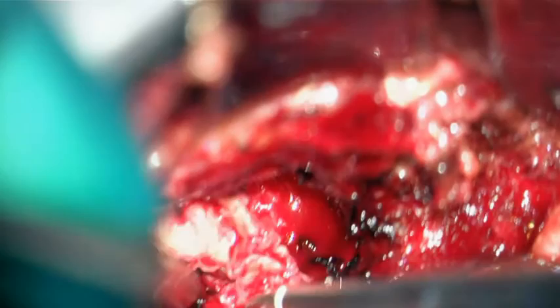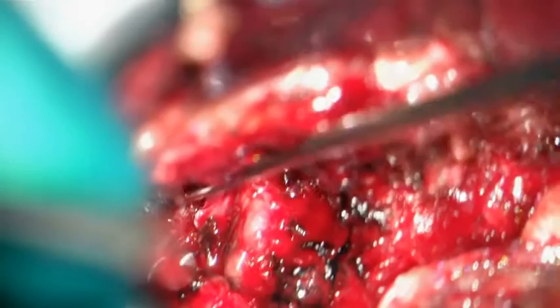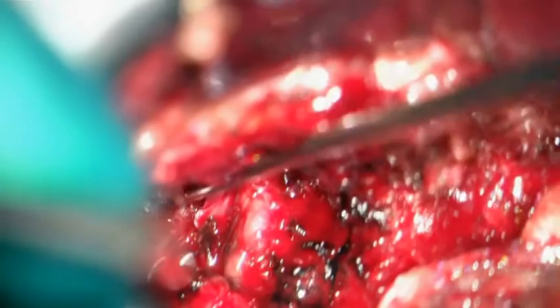The fragmented disc material is resected, and the exiting nerve root and radicular artery are exposed and decompressed by removal of extruded disc fragments in the foramen. The surgery is finalized and the wound is closed.